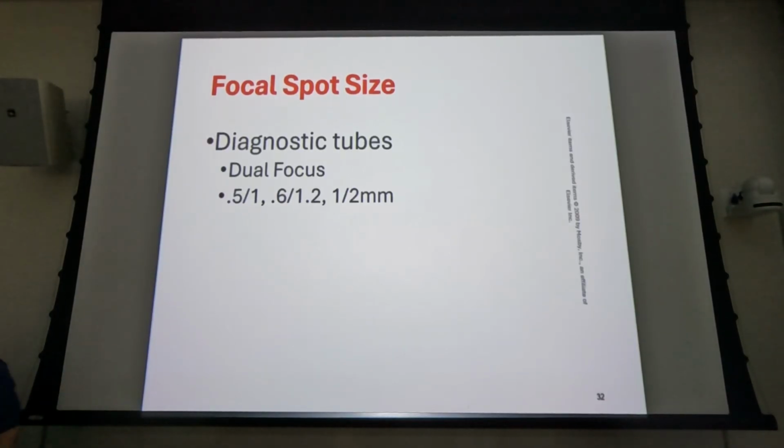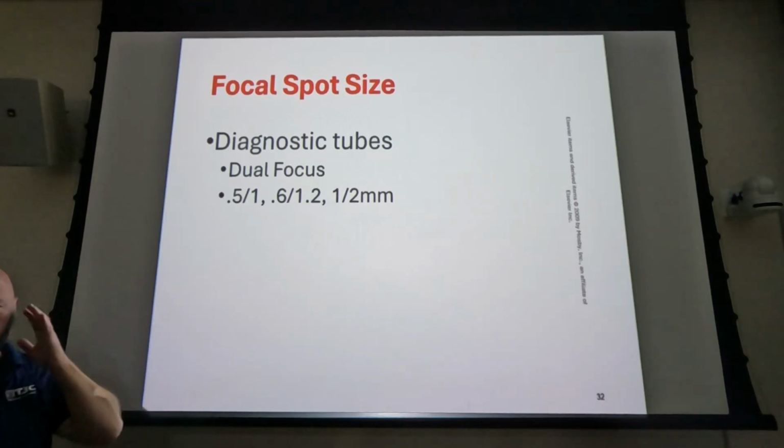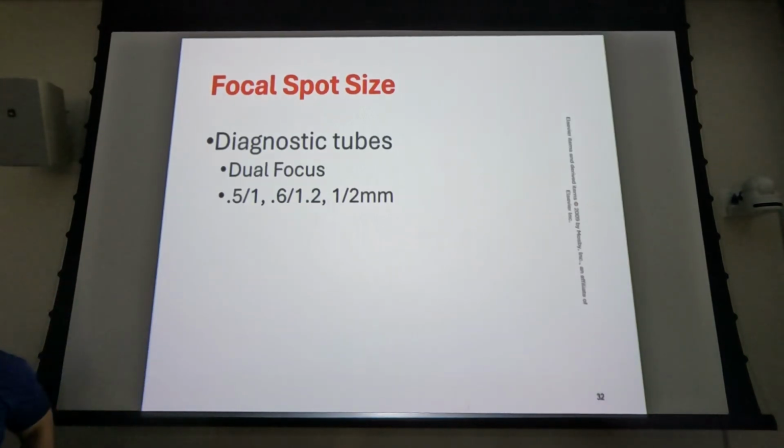For the most part, yeah. It's not good. We want the sharpest image we can get. But how small is 2 millimeters? Pretty tight. Pretty little, right? So what's the main thing that's going to kill your X-ray tube?